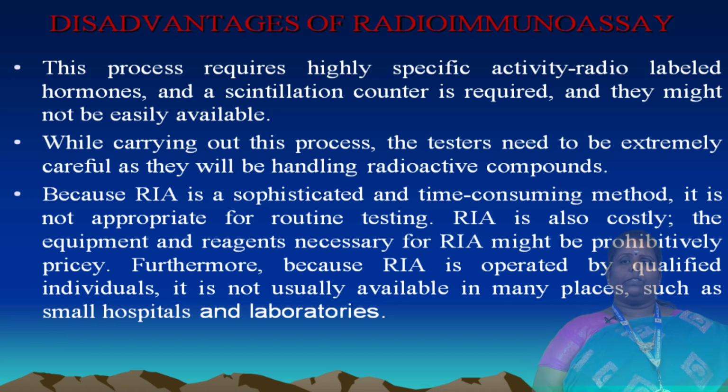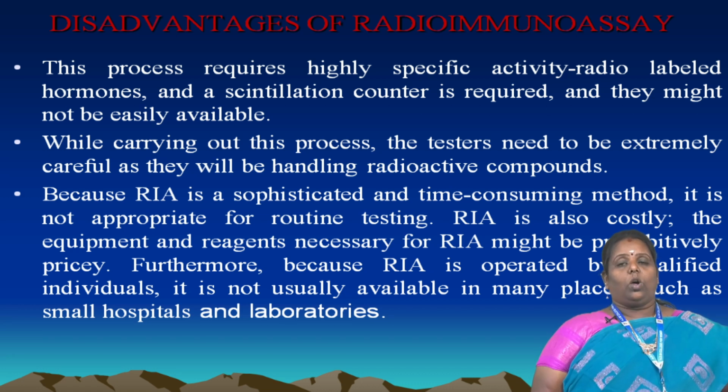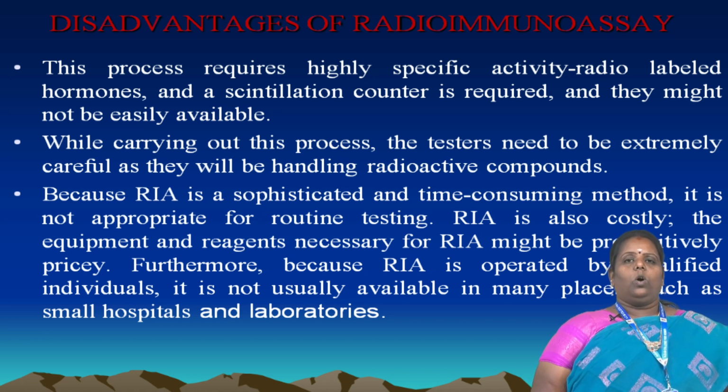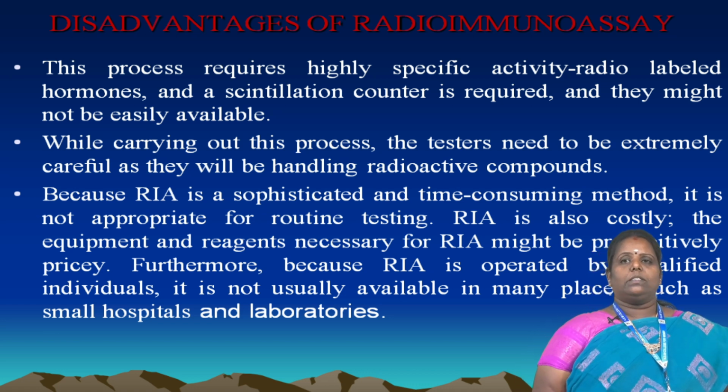Furthermore, RIA is operated by qualified individuals. It is not usually available in many places, such as small hospitals and laboratories. So the highest-level laboratories and hospitals avail this RIA technique, and we go to those places for testing.